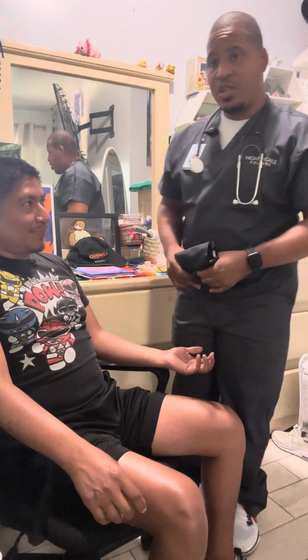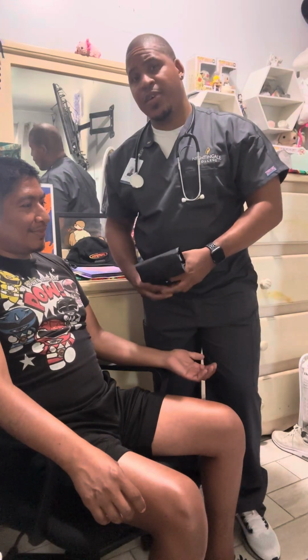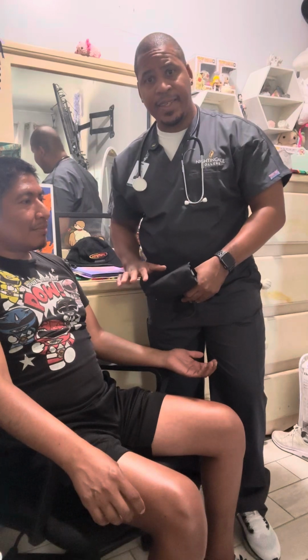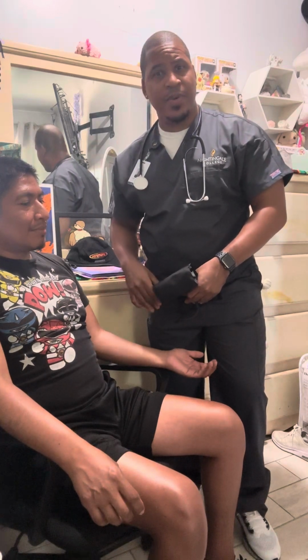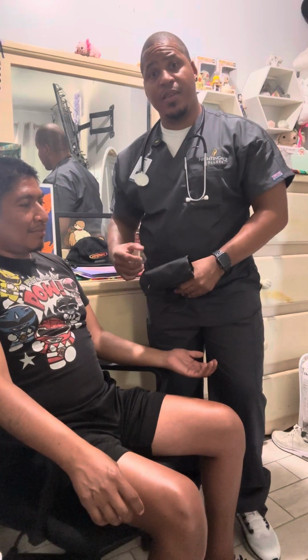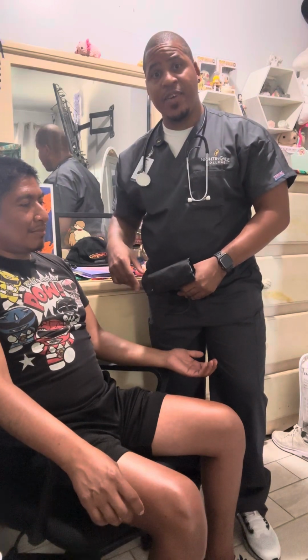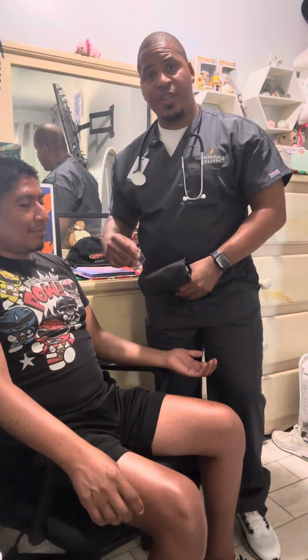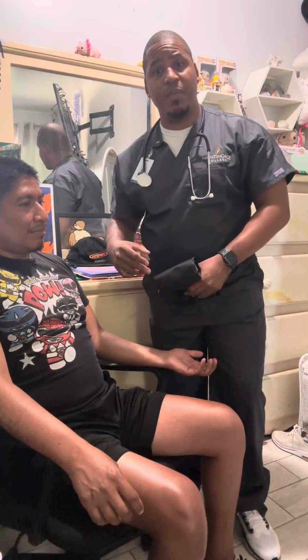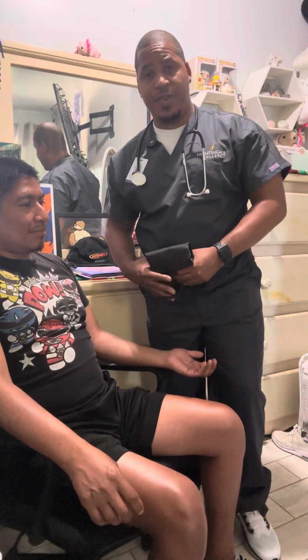No. So he doesn't know his baseline. So I'm going to estimate the blood pressure to be at 120. When inflating it, I want to add 20 millimeters of mercury to that 120. So I would inflate it to 140.